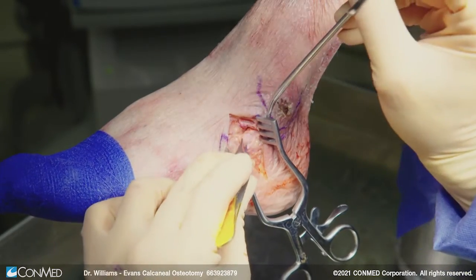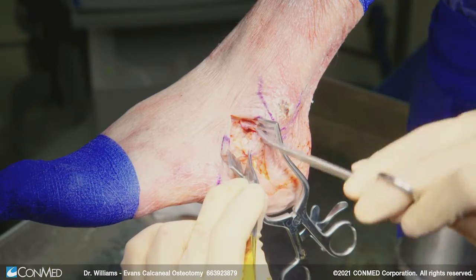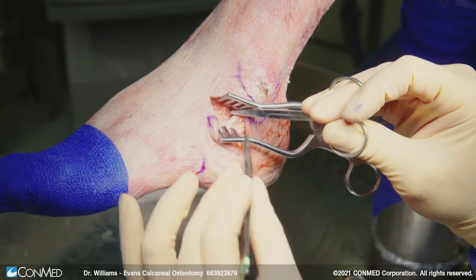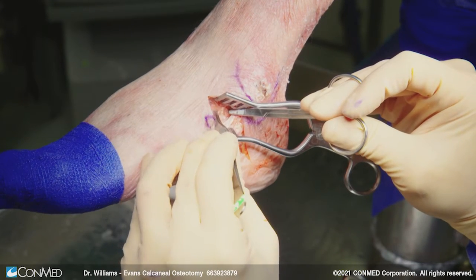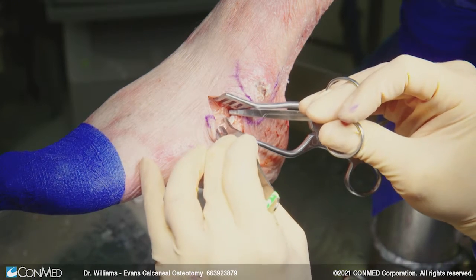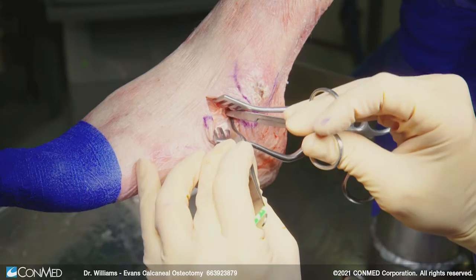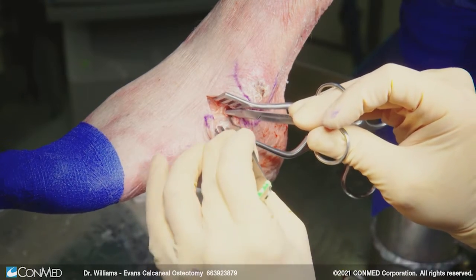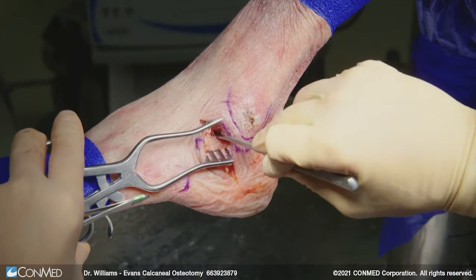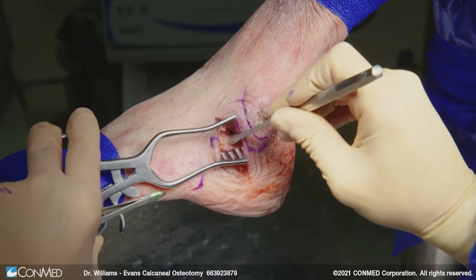Let's come in here and just elevate that off. You can see that coming into view — right there is the peroneus brevis. Here's one of the landmarks I'm going to look for: this is the anterior process of the calcaneus coming up, peroneus brevis right here at the bottom of that surgical field. I've been able to insert this tenotomy scissor right here, going right at that inflection point in the calcaneus. I've got my posterior facet right here; it's going to angle and deflect up. That point invariably will be right about where you want to make your osteotomy.